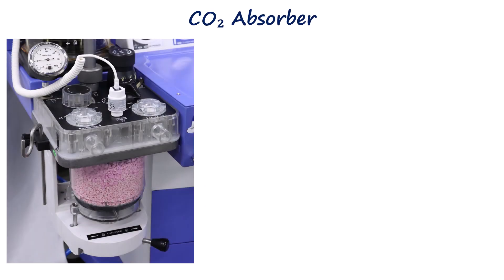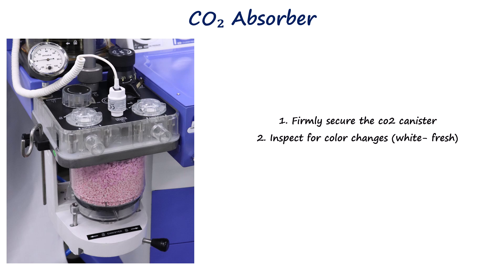The CO2 absorber must be firmly seated with no leaks. Soda lime should be inspected for color and replacement time. Fresh absorbent is typically white, while violet or pink indicates exhaustion, though color changes depend on the type of absorber used. As the color may revert to white on standing, it is important to check the date of the last change.